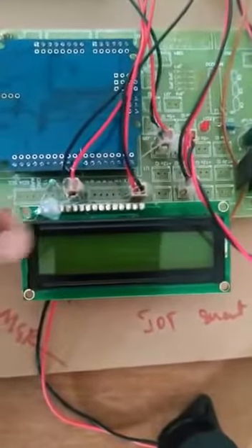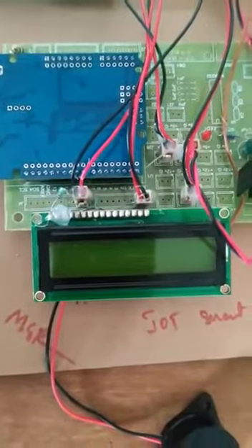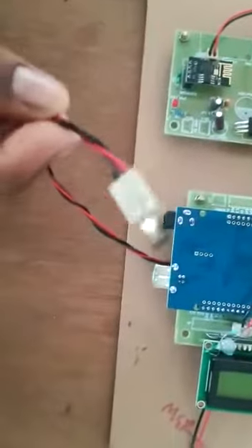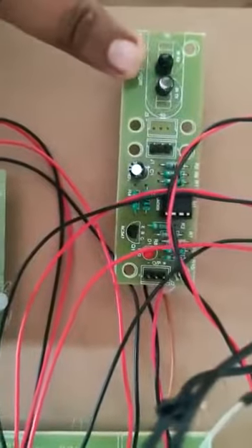This is the LCD display. It is a 16 by 2 LCD that displays 16 characters per row. This is the temperature sensor, which is used to measure the body temperature of the patient.